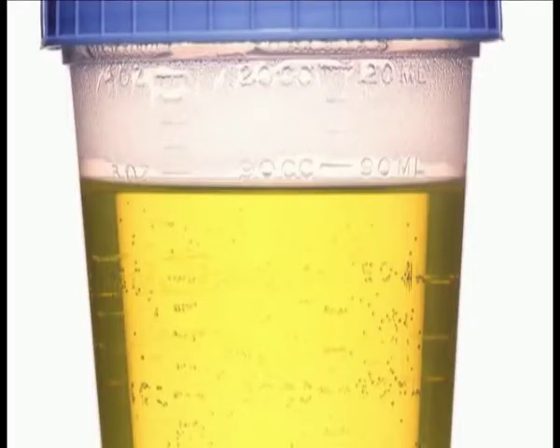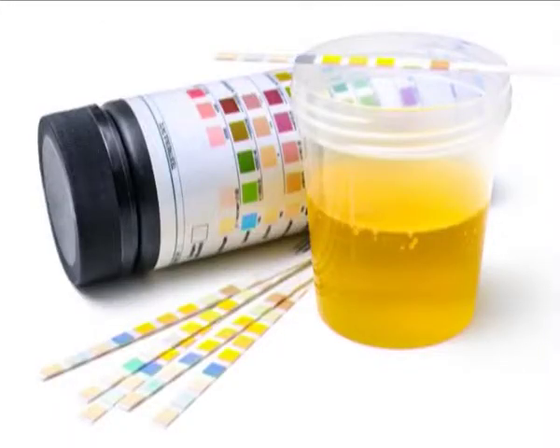The target parameters that can be measured or quantified in urinalysis include naked eye, that is, gross examination for color and smell, plus analysis for many substances and cells, as well as other properties such as specific gravity. A part of urinalysis can be performed using urine test strips, in which the test results can be read as color changes. Another method is the light microscopy of urine samples.